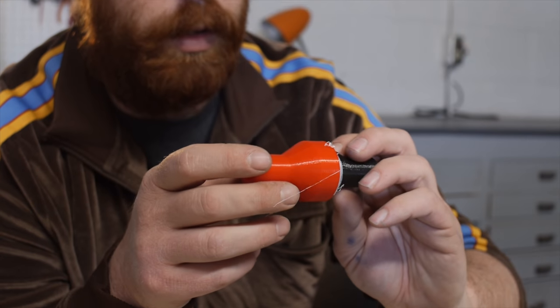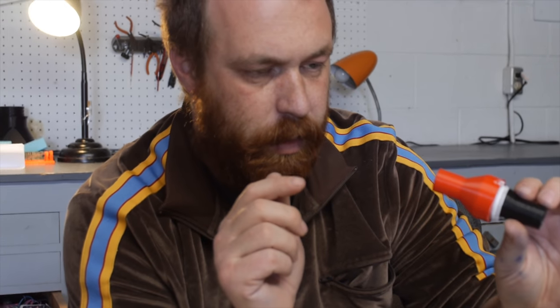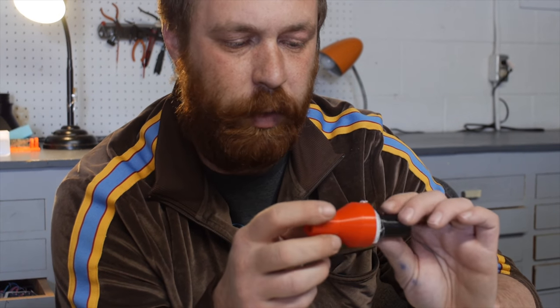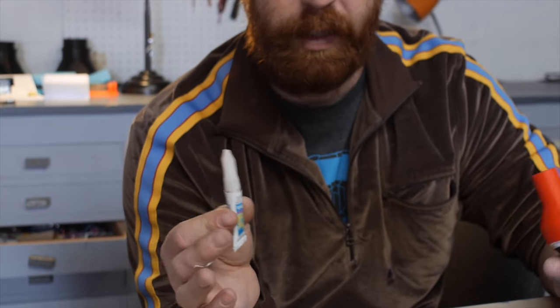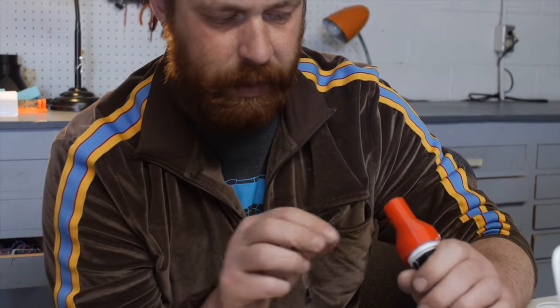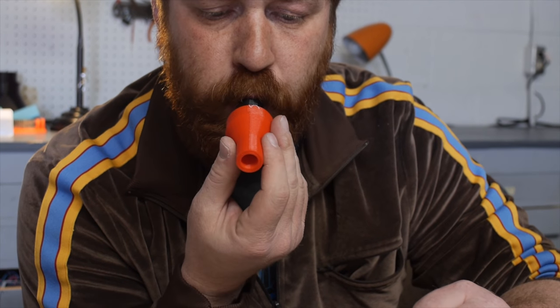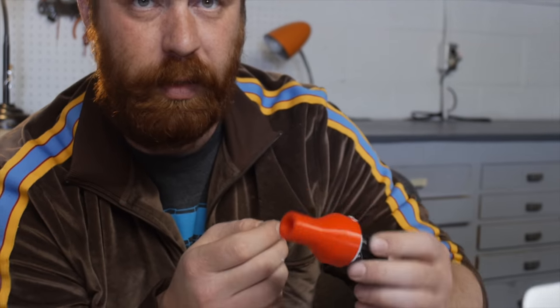Maybe I will make a quick mod to the design where the diaphragm is screwed instead of glued into place, just to remove any super glue. Although you used super glue to glue your finger together today, I think it was invented for battlefield wounds. I wouldn't go breathing it all the time, but it's a really tiny amount. I hope somebody can use this usefully.